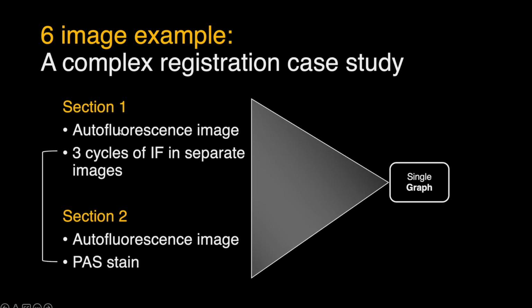So we can actually constrain the more complex serial section registration problem to a monomodal registration, while the same section data registration is always multimodal, which is a little bit less challenging because it is the same tissue section. So there's expected to be similar content. And we'll now demonstrate how to set this up in napari-wsireg.